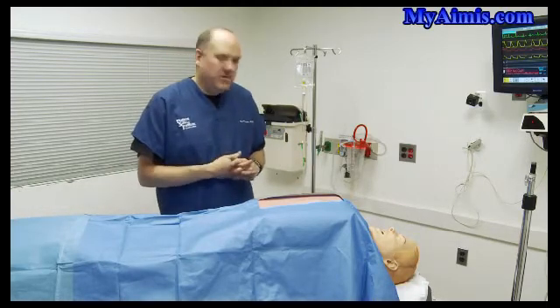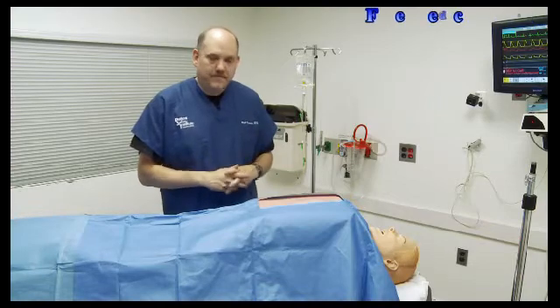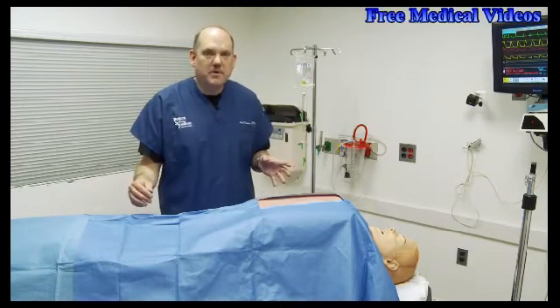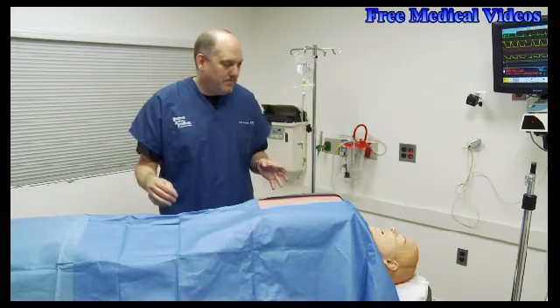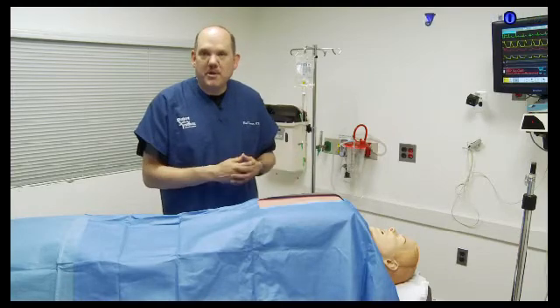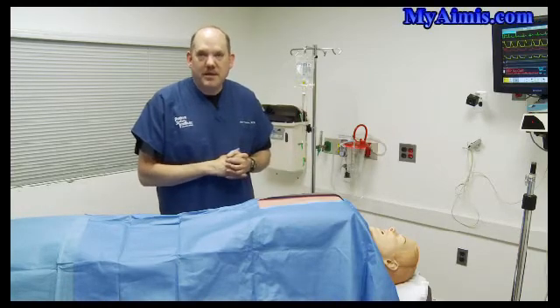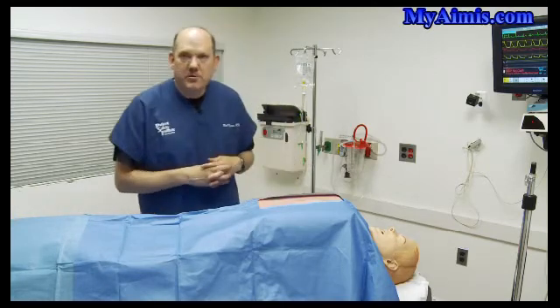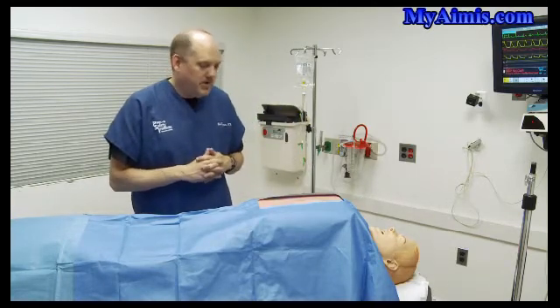So we sat down and thought about how we can accomplish the cracking of the chest while the rest of the team carries on with the cardiac arrest. What we came up with is a homemade project using a project box that is commercially available. I'm going to show you how we put this together, and hopefully you can make good use out of the same basic principles.